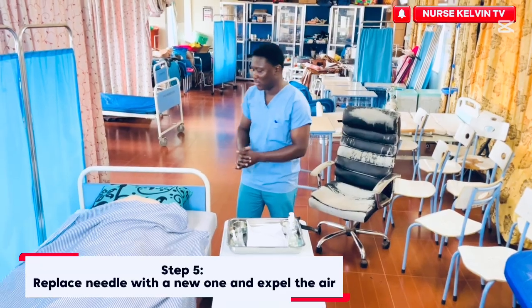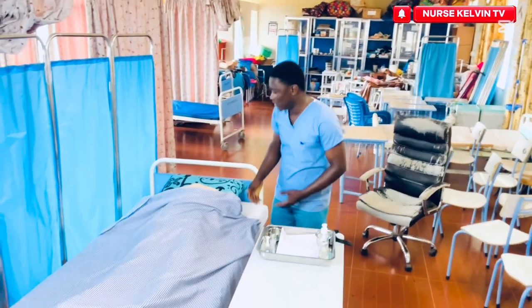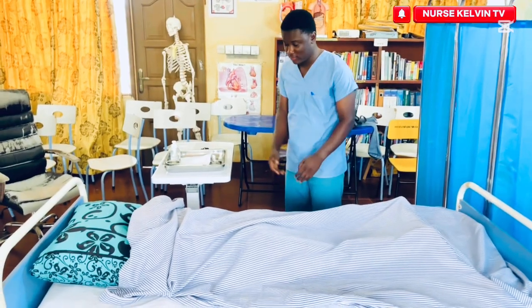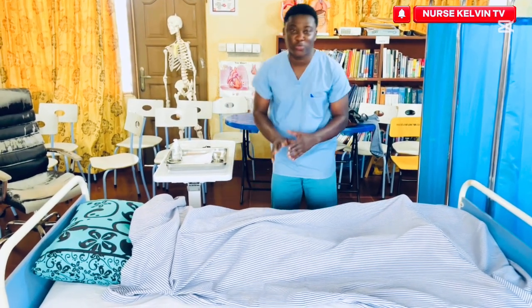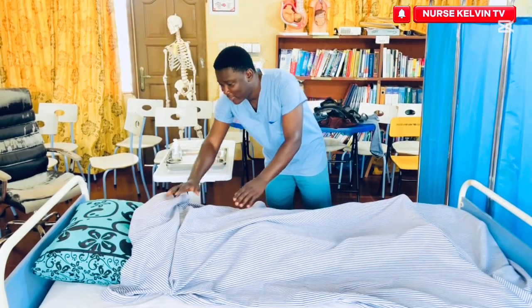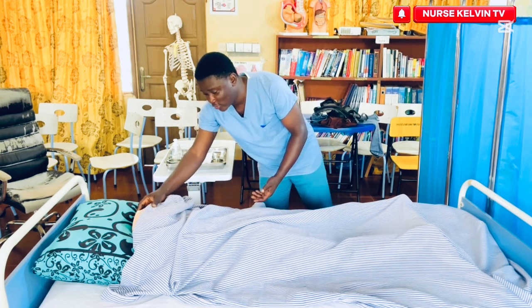Afterwards, you need to come to the patient. So we are ready to give you the medication, guys. Now we need to expose the area that we are going to inject the medication. You need to let the patient be aware. Okay, sir, so sorry.